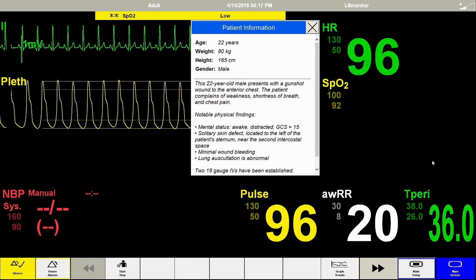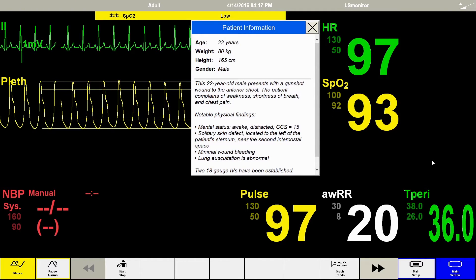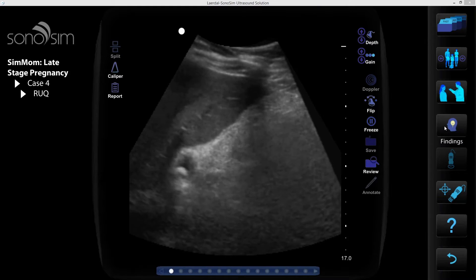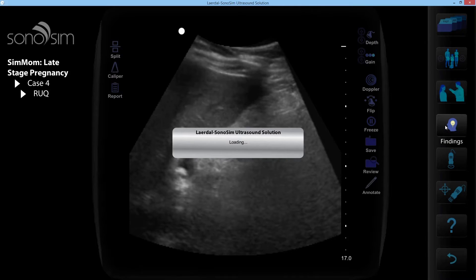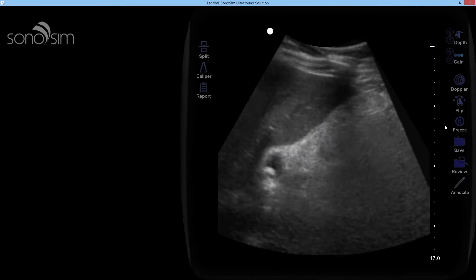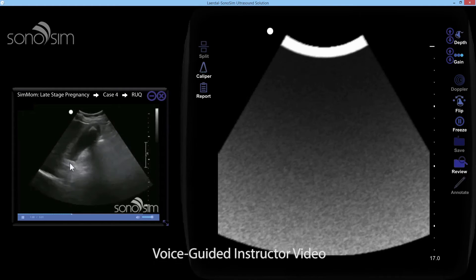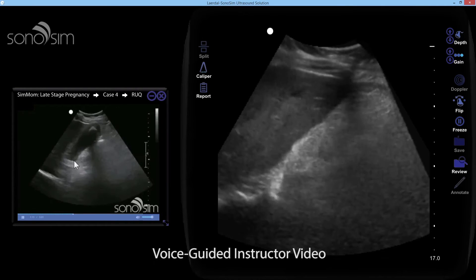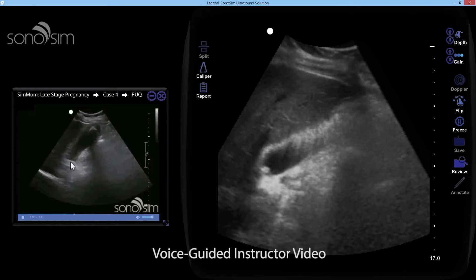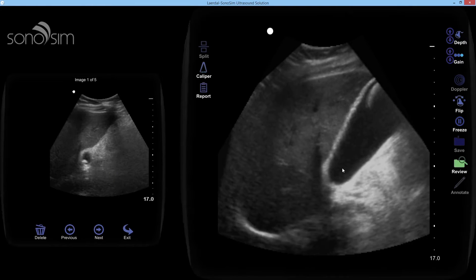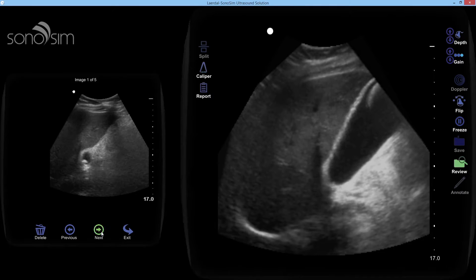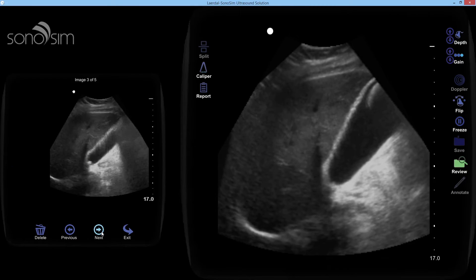The scenarios are designed to be a self-contained curriculum. After completing a simulation, learners may watch a guided virtual instructor video or review ultrasound imagery taken during the scenario. Therefore, an ultrasound expert does not need to be present for the learner to review and learn from the ultrasound images.